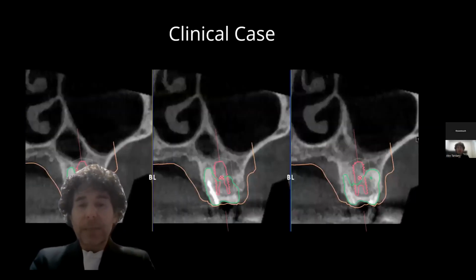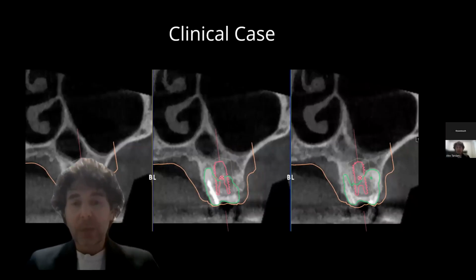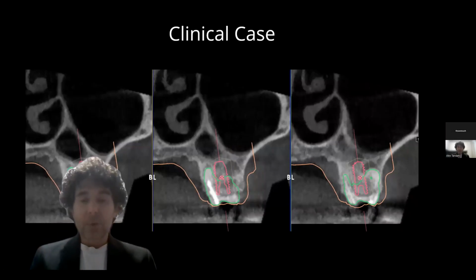So you can see here, we superimposed the implant on the septum, practically in the center of the socket. Here, we could have also considered placing it a bit more palatally, but in my opinion, the width of this septum allowed me to use the mallet. This is where the mallet makes the difference, because by not drilling, I was able to displace this amount of bone and obtain, as you will see later, a type A socket.